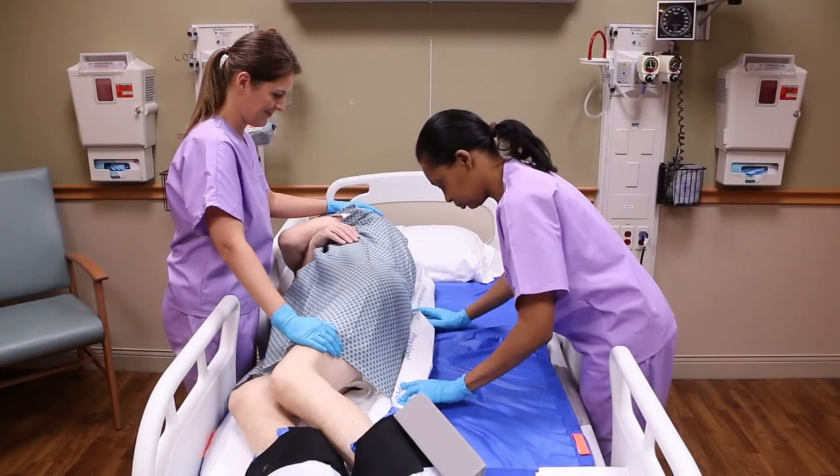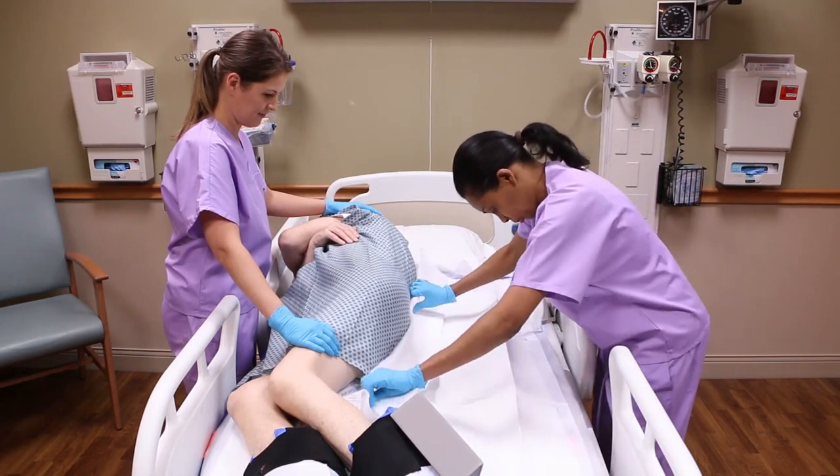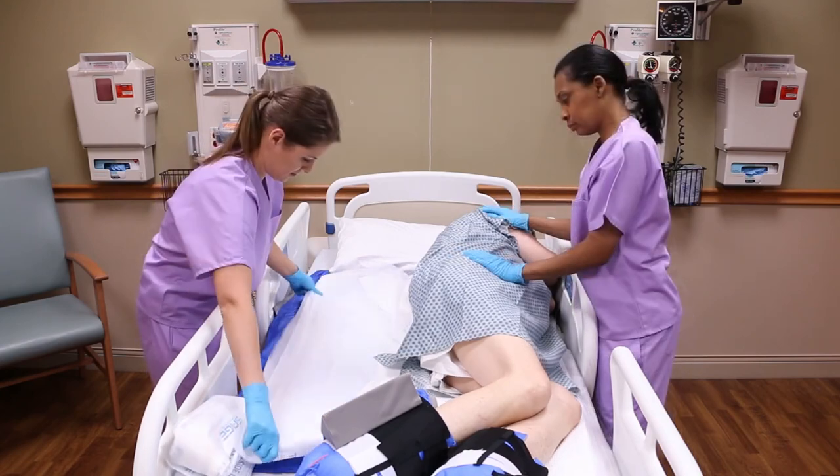If the microclimate body pad becomes soiled, follow your facility's policy for placing items beneath the patient to remove the soiled body pad and replace it with a new one.